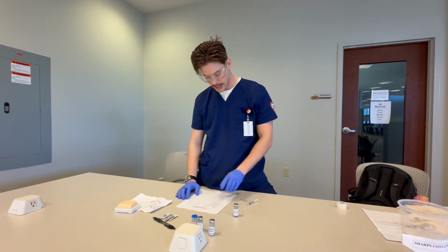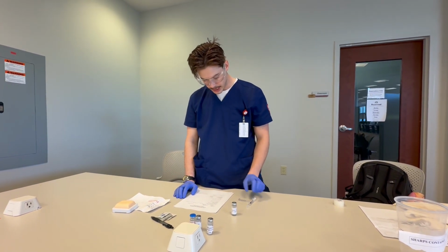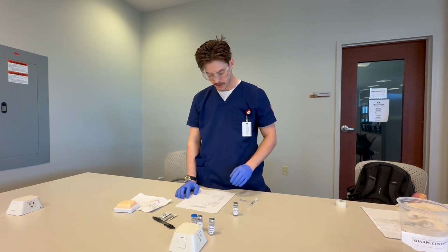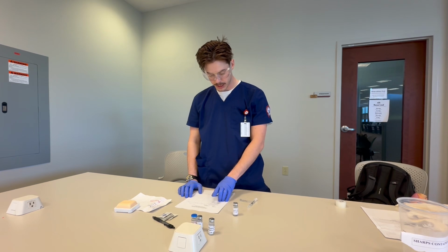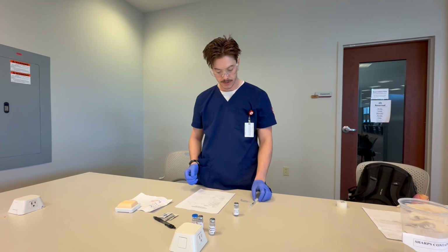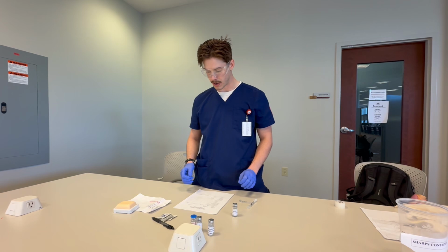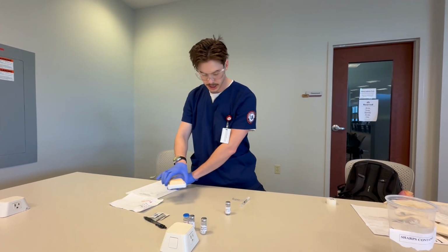All right, and that is what is prescribed here. This is a subcutaneous needle. I will be giving this subcutaneously, so this is the right needle for this procedure. 30 minutes before a meal, which is the right time and right indication. It is 30 minutes before his next meal, so I am giving this at the right time. All right, all elements of a legal prescription are present, so I will proceed with the injection.